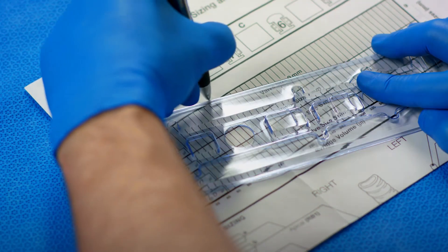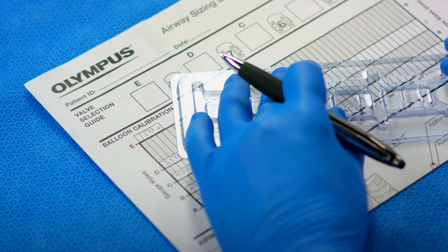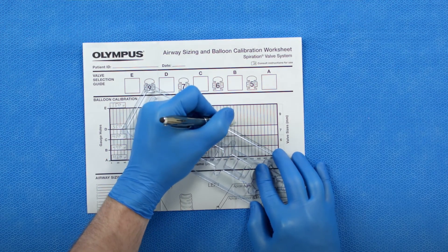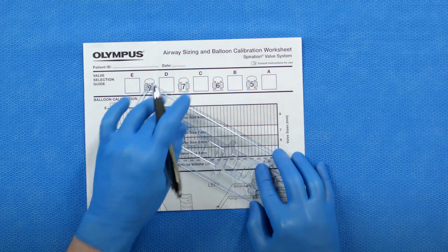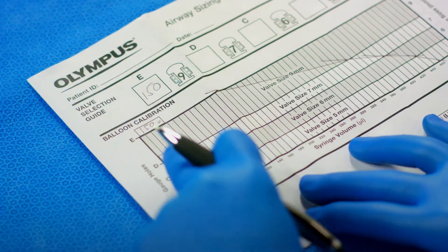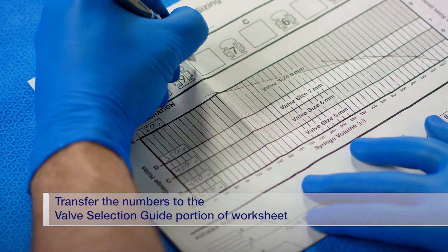After all the gauge hole sizes have been recorded, plot the values and connect each of the points on the balloon calibration section of the worksheet with a straight line. Verify that the curve is continuous, then transfer the numbers to the valve selection guide portion of the worksheet.